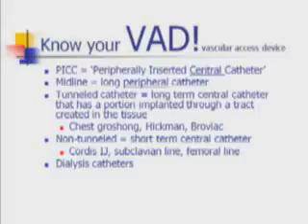This slide provides basic definitions of catheter types. PICCs are long, central lines usually placed in upper arm veins with the distal tip residing in the lower one-third of the superior vena cava, or SVC. In contrast, midlines are long peripheral lines with the distal tip residing in the shoulder area. Midlines are only appropriate for a few specific infusions, while PICCs are appropriate for most infusion therapies, especially those that are longer term. Tunneled catheters are also appropriate for most infusion therapies and are particularly well suited for long-term needs.